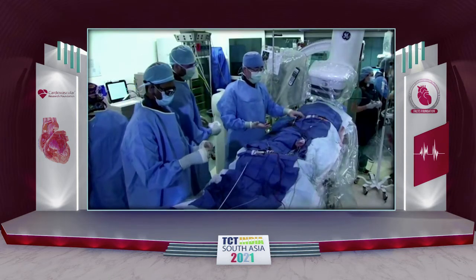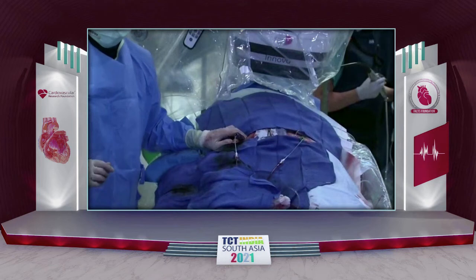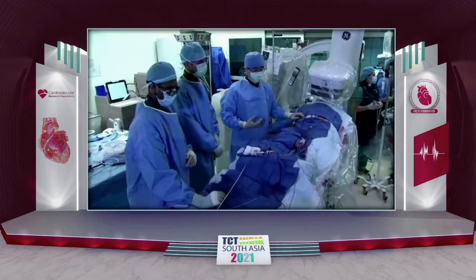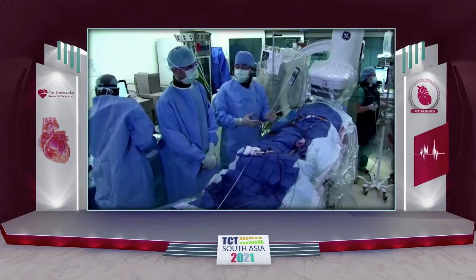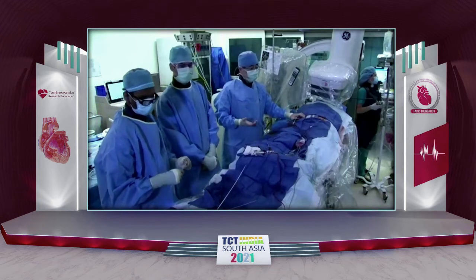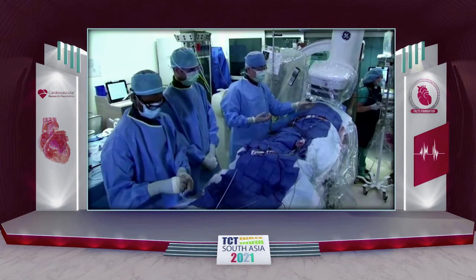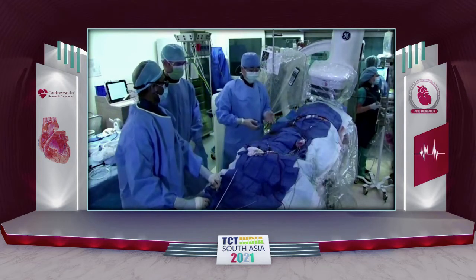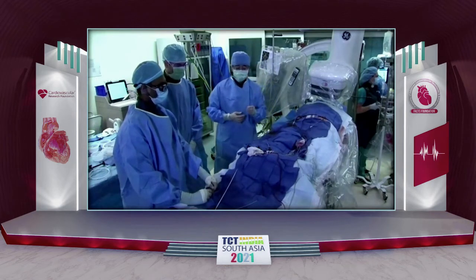However, my goal is to make this 14 French or even bigger hole like a 6 French or 8 French equivalent. And unless patients have any contraindication, then we do the protamine and reverse, and then do the manual hold of the groin. And most likely it's going to take care of all the hemostasis for the big bore catheter. Now, if you have a more significant, really bad pulsatile flow, then the next strategy depends on how things go. I usually like to look at the iliac artery, make sure there's no significant stenosis, just only extravasation. Then if there's no stenosis, we will just put the 6 French, 8 French, or 11 French sheath back in there, and it terminates the bleeding completely.